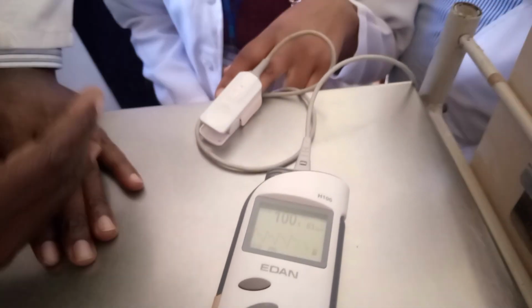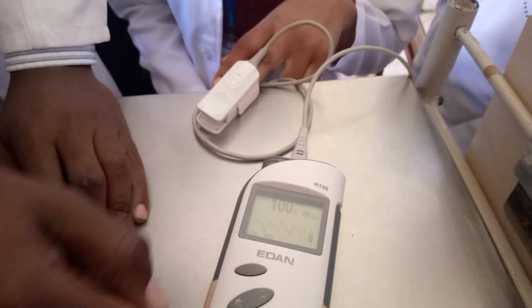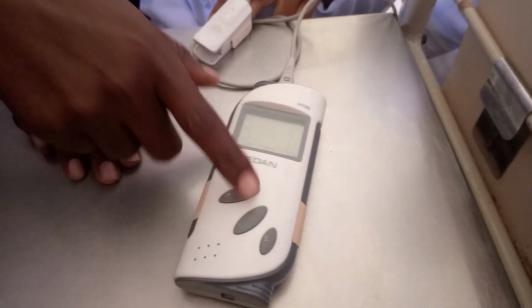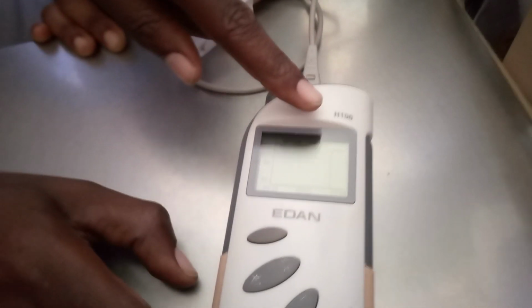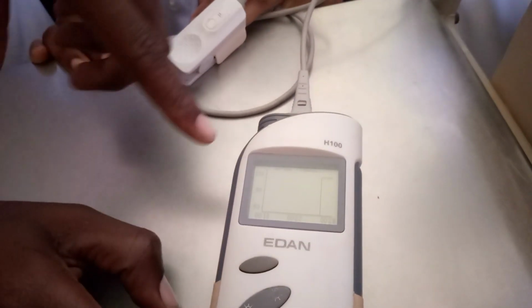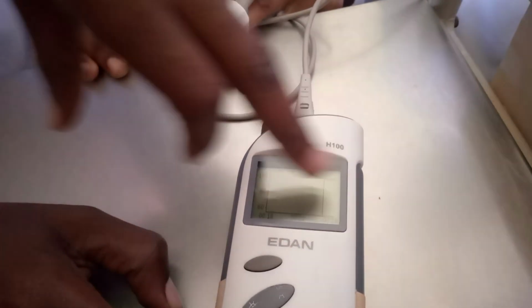Now, in case you're using it continuously on a patient, what will it show? It will show you what we call trends. You come to this button; there are different types. When you press there, it will show you the trends. This is the SpO2 trend, meaning it will show you the previous readings. It will show you how it was able to store the readings for the patient, so you refer to this.